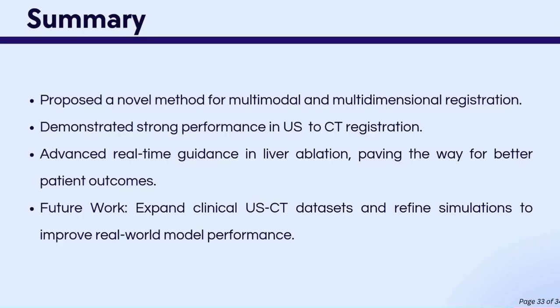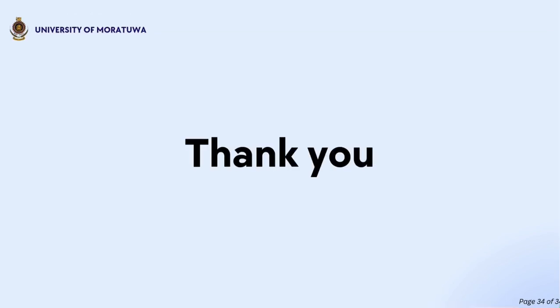So, in summary, we proposed a novel method for multimodal and multidimensional registration. We demonstrated a strong performance in ultrasound to CT registration, and we also give advanced real-time guidance in liver ablation, paving the way for better patient outcomes. And in future work, we would expand clinical ultrasound CT datasets and refine simulations to improve real-world model performance. Thank you.